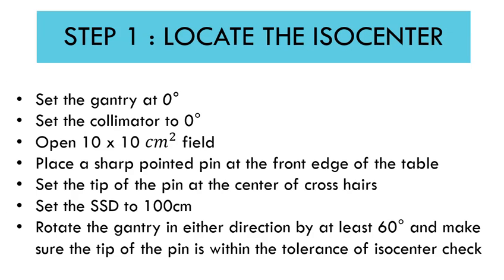The first step is to locate the ISO center. Set the gantry at zero degrees, collimator at zero degrees, open a 10 by 10 field, then place the sharp pointed pin at the front edge of the table at the center, so you can see the shadow of the cross wire passing through the pin. Set the tip of the pin at the center of the crosshair and set the SSD to 100 centimeters.